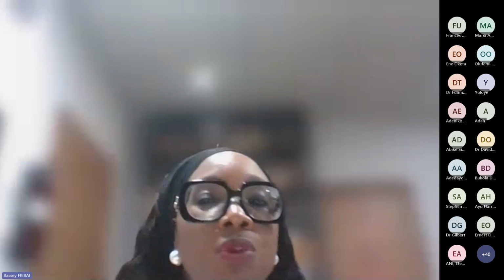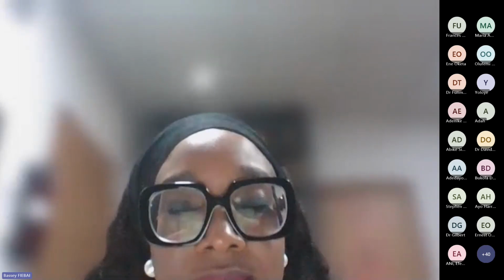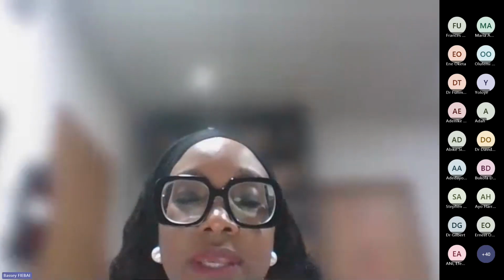So you will see your membranous opacity with a high spike, with very restricted movement, attached to the optic disc. And you will also see your dome-shaped membranous opacity coming from the periphery. And you will know that there's more than one pathology here.